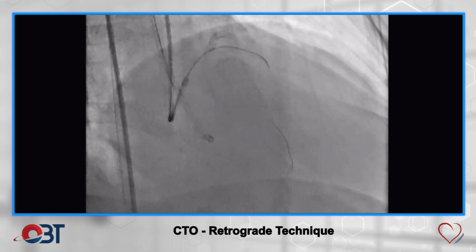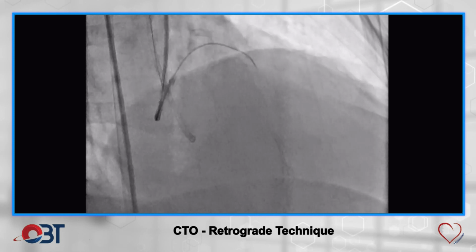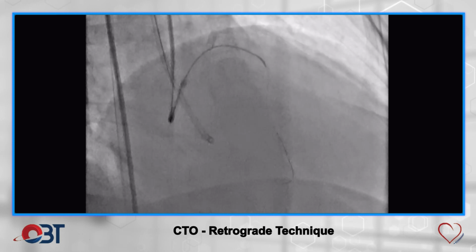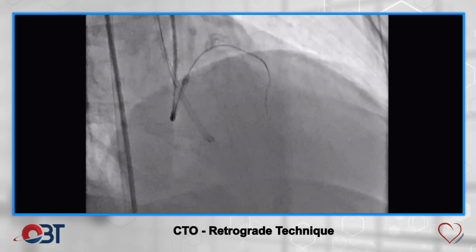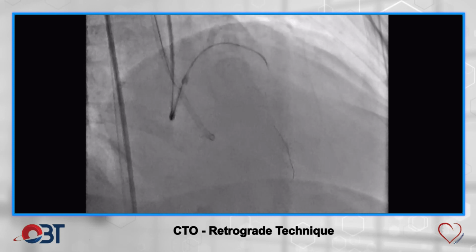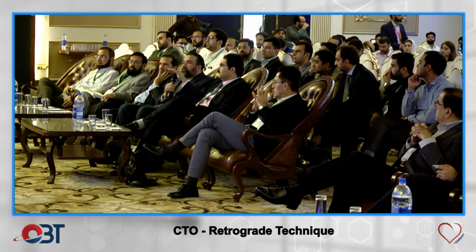because I think just like you showed, even though there wasn't a whole lot of connections, sometimes that contrast will open up some microchannels, and then try the Sion black again. So that's one thing. SUOH, I think you made a good point, because SUOH actually doesn't work as well in the muscular collaterals, and in fact, the more you torque, it turns into a knot, and it's very hard, you lose the wire, so you end up wasting a wire.